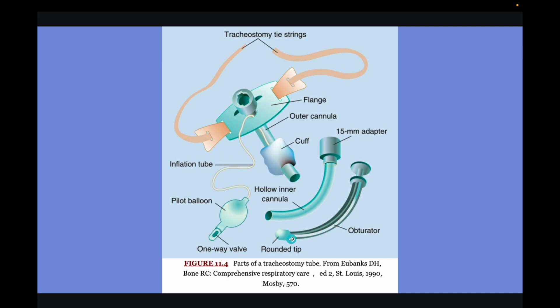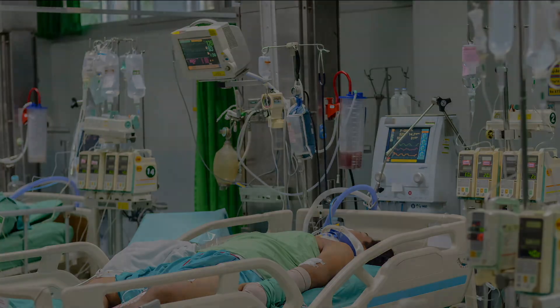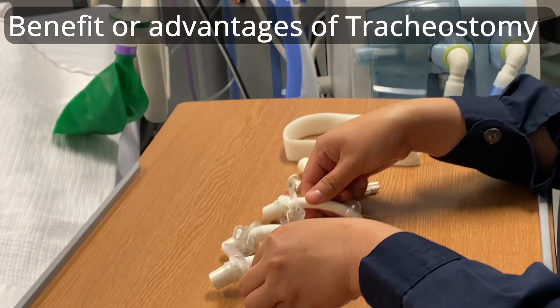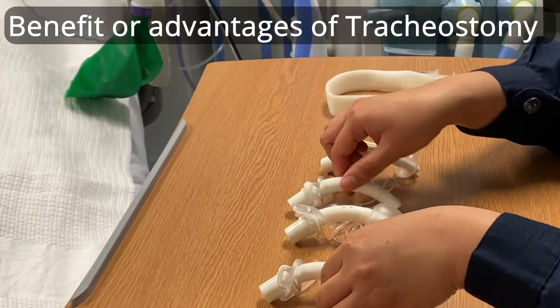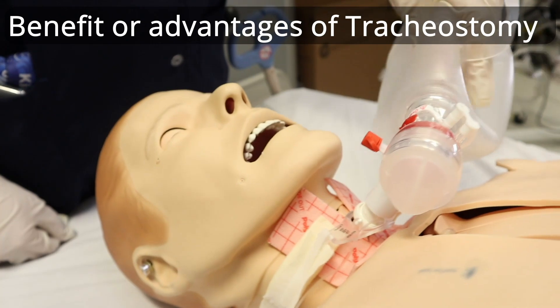Here we can see the inner cannula where it is inserted, and the obturator, which is used when inserting the tracheostomy. Now let's look at the video to learn more and see these components more clearly.